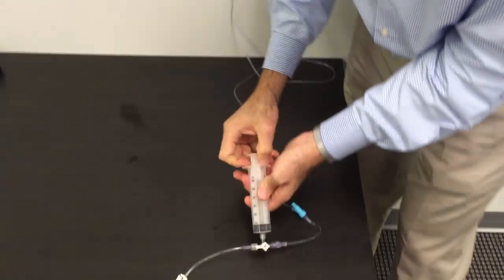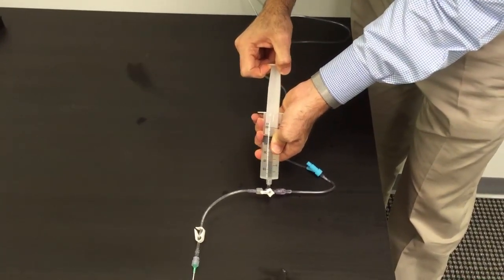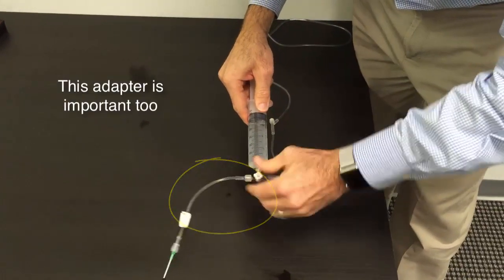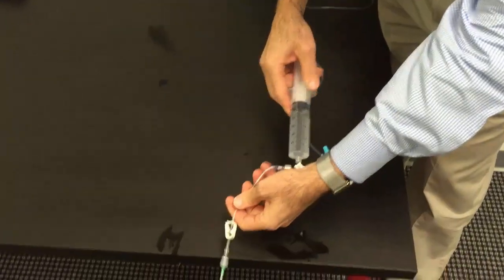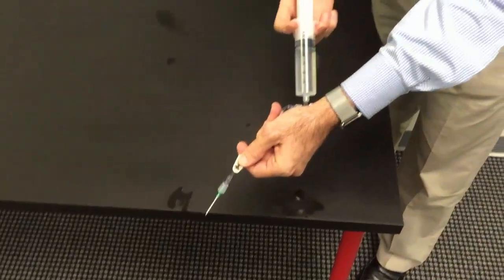And then we can turn off to here, and then we'll push right into the patient, and I'll squirt a little bit, and it goes right into the patient that way.